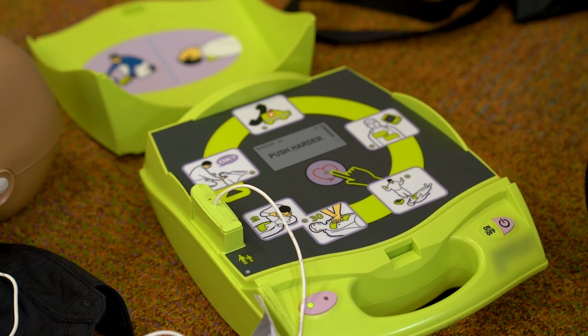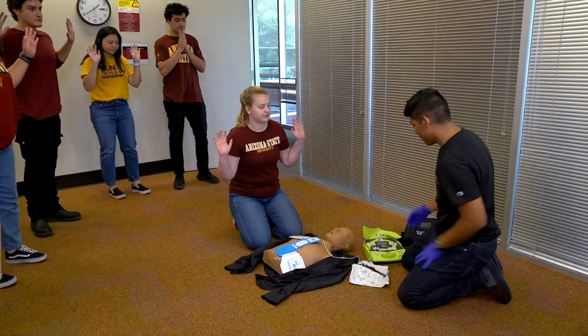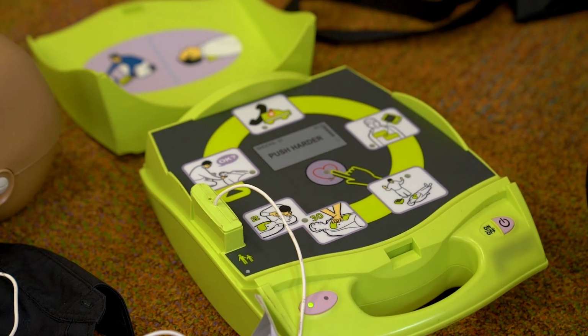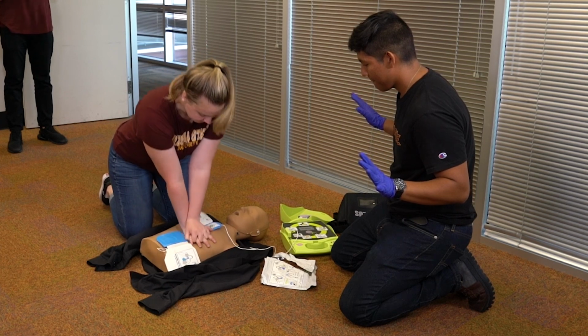Shock advised. Don't touch patient. Tell everyone, stand clear. When everyone is clear, press the flashing shock button upon the AED's command. Press flashing shock button. Shock delivered. Start CPR. After the shock, immediately resume chest compressions.